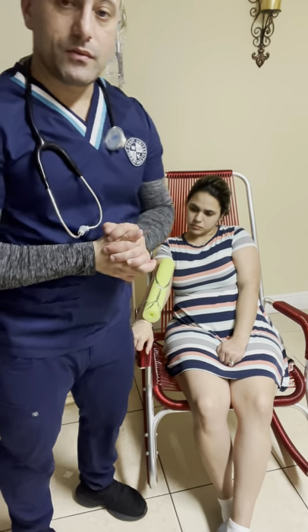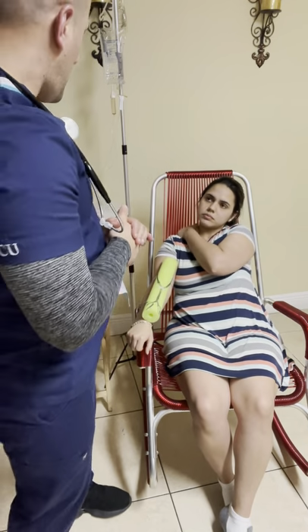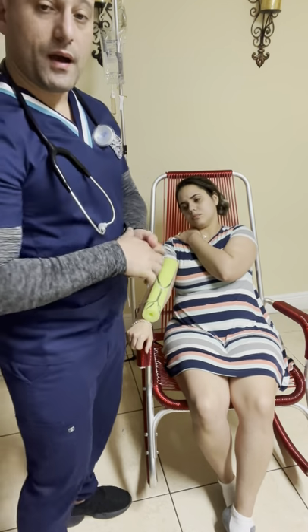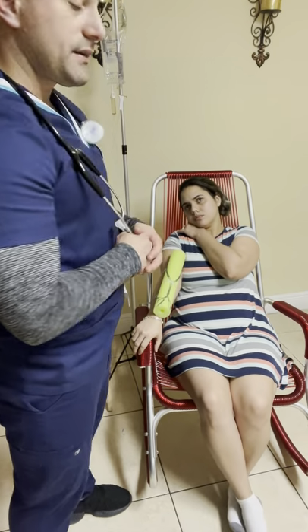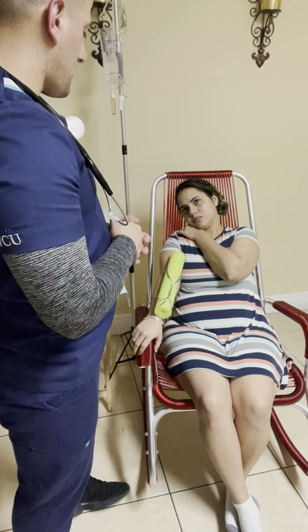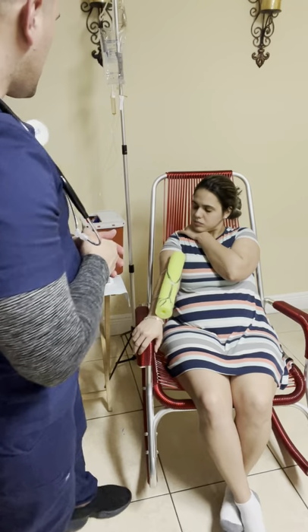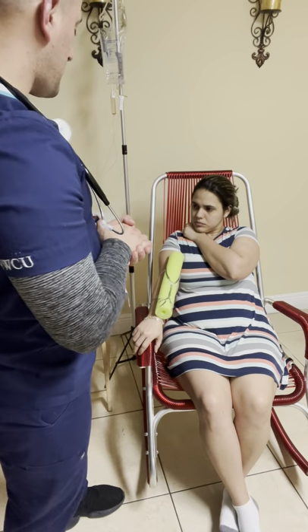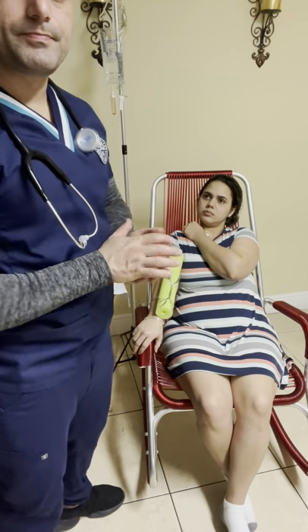Now I have to document all the procedures. I have to describe the skin assessment before and after the catheter was taken off. Also, I have to describe if the patient has no bleeding or any discomfort, and that's it. Thank you.